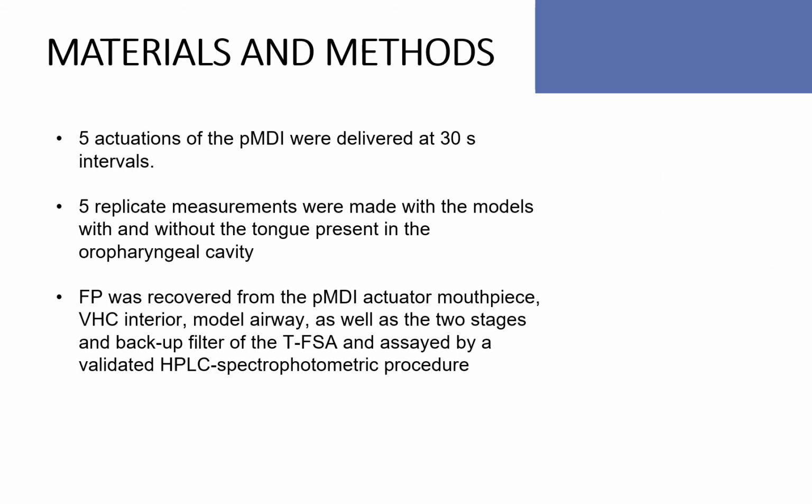In all instances, 5 actuations from the MDI were delivered at 30-second intervals and 5 replicate measurements made with the models with and without the tongue present. And lastly, fluticasone was recovered from the MDI actuator, VHC interior, model airway, and all the various components and analyzed with HPLC.